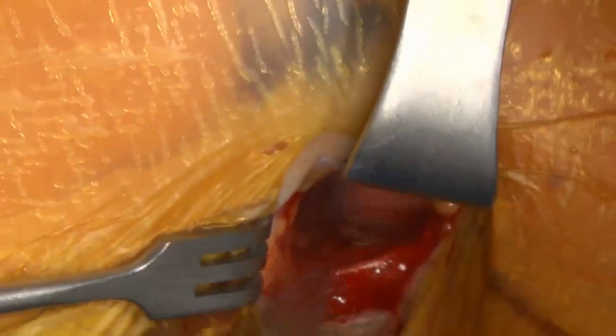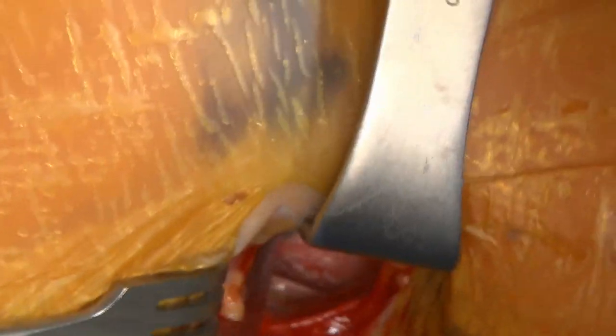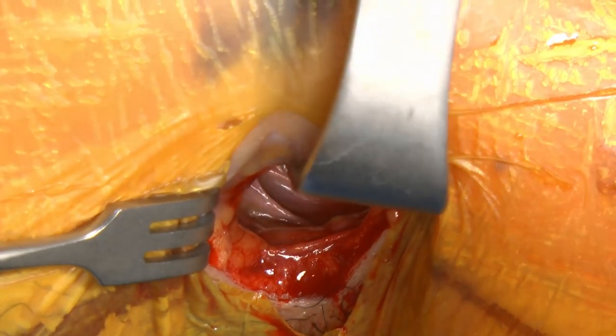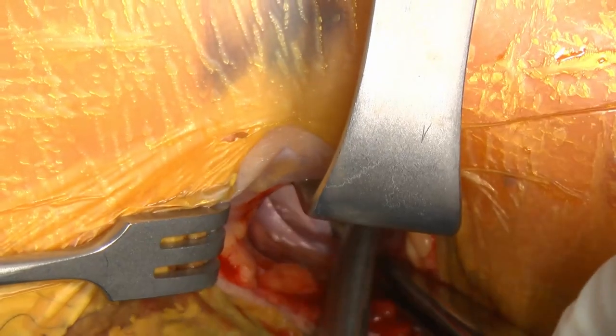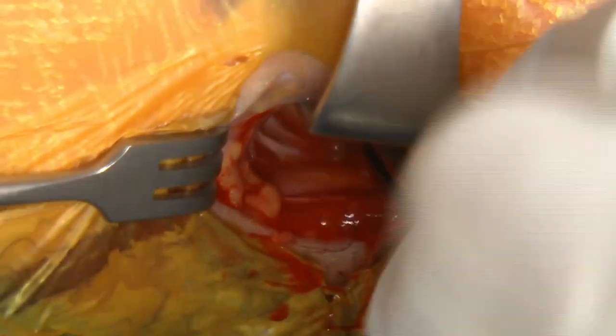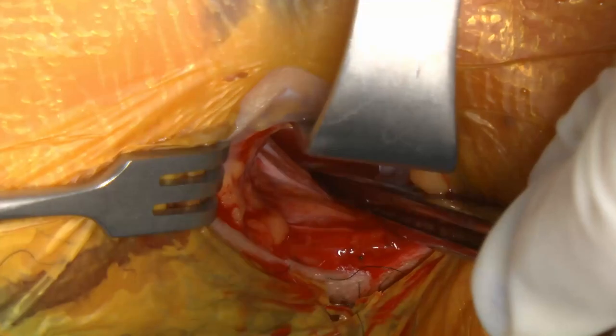Okay, so we lift up on the pec, we see the biceps, the short head of the biceps. If we just stay right next to the pec and slide on down, then we'll get to the long head of the biceps. Sometimes it's easier to actually feel with your finger so you know exactly where it's at and not get confused. I'll pull my finger out in just a second.